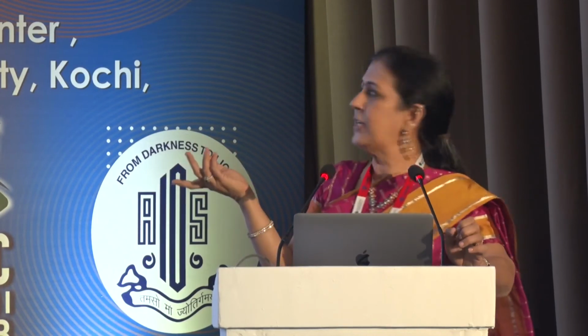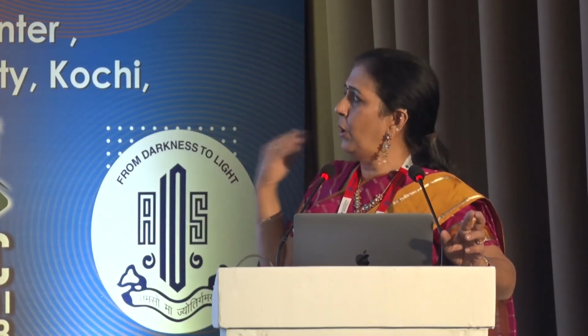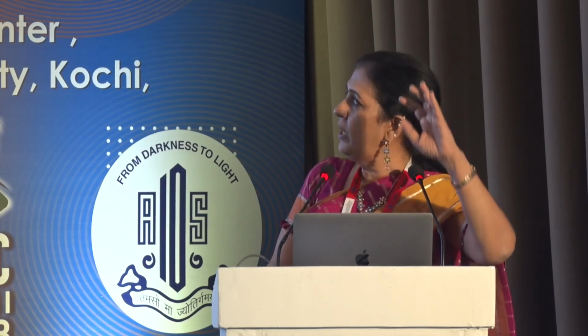If the vitrectomy is adequate and you stain and you realize there's no vitreous, you need not even do a PI, because a pupillary block is going to occur only if there's vitreous. And after doing a vitrectomy, if the pupil is large, I would inject pilocarpine before I place my iris clip. But as the pupil was small, the pilocarpine is not placed, and I position my iris clip lens in the usual manner, stabilizing the optic of the lens. I go to the side port and push in the iris to get caught in the pincer-like haptics of the iris clip lens on both sides, and so complete the case.